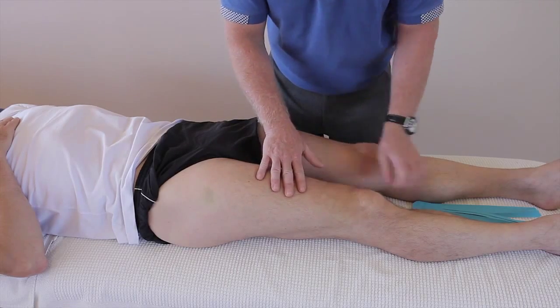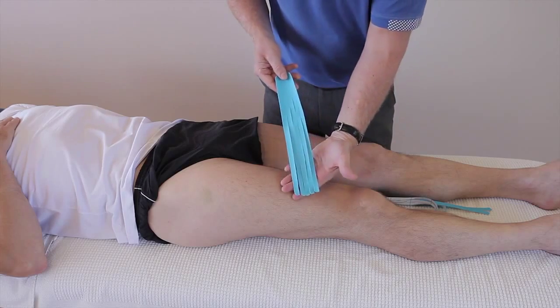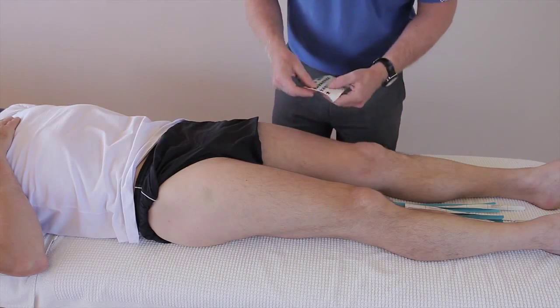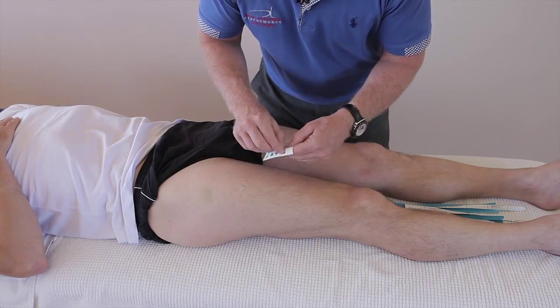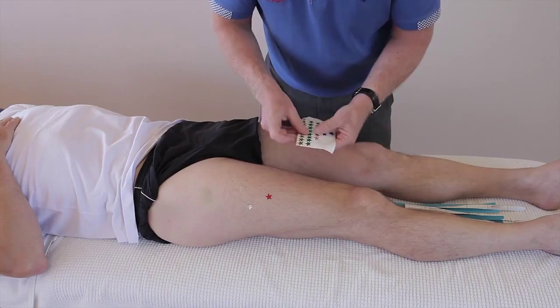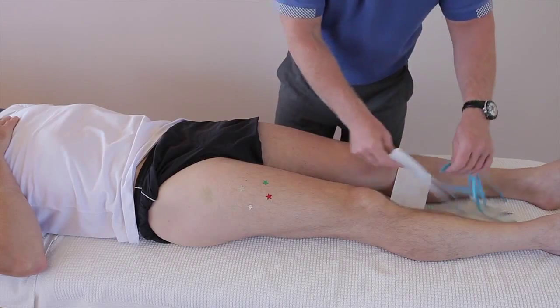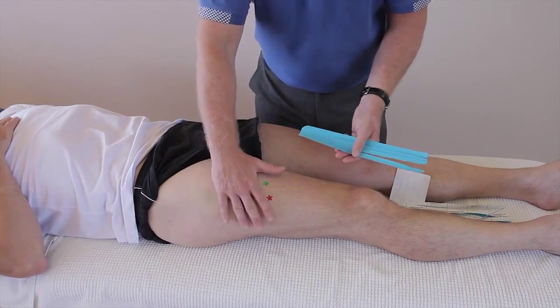of pain and swelling. In this case, we prepared an I-strip, slightly longer, and cut 5 individual fingers, and we've done that twice. So I'm just going to mark where the pain and swelling would be. It might be in a few areas. The swelling might even be down to the actual knee. So if we isolate this area where the pain would be, then we're going to cover that area. The fingers are actually going to cross over the pain.